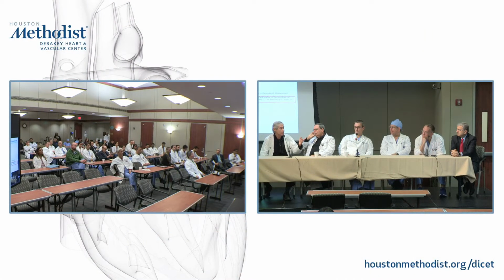The other thing that was interesting about this case is that there was some question of a paravalvular leak as well, or whether there was central leaking. And like I said, we can see very nicely with these mechanical valves whether there is any central aortic regurgitation, as well as whether there's a stenotic area because it's not opening properly. And we can also look, particularly if there's any anatomic formation around the valve that would lead to a paravalvular leak. So we can see contrast going around the annulus into the ventricle.